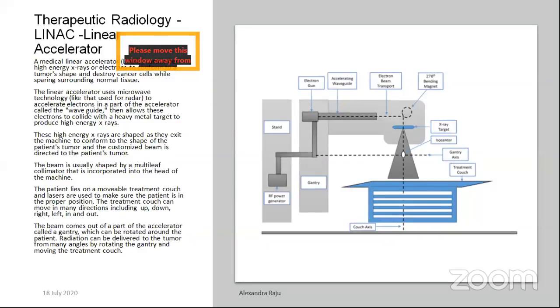So let's summarize the radiological equipment due to the lack of time. Let's see what is LINAC. LINAC is a linear accelerator, which is mainly used for therapeutic purposes. It also uses X-rays, with high energy X-rays used. This is targeted at the tumor cells to destroy them. See from the block diagram. So those are the major equipment used in radiology departments.